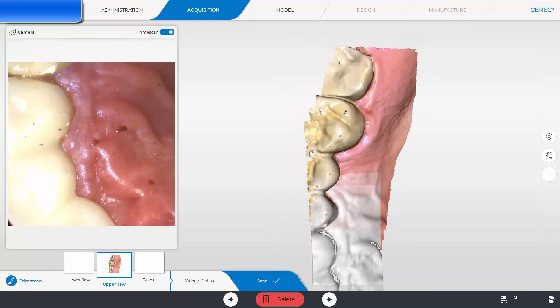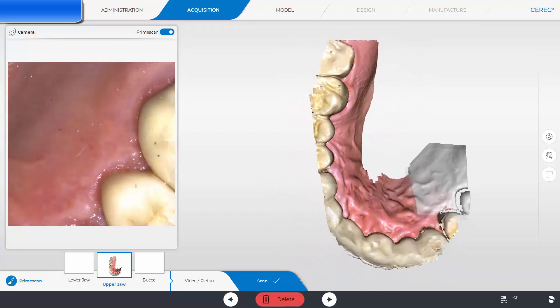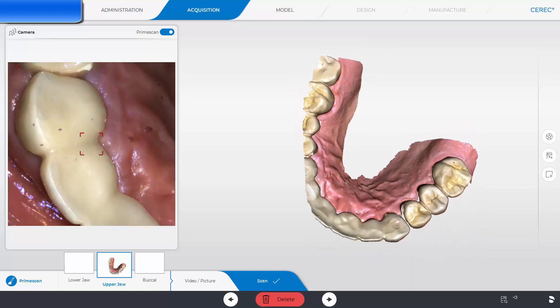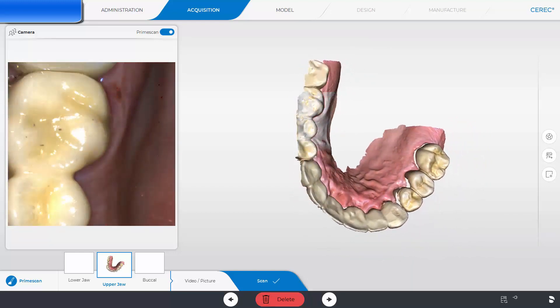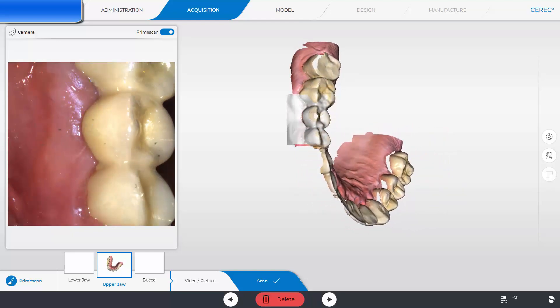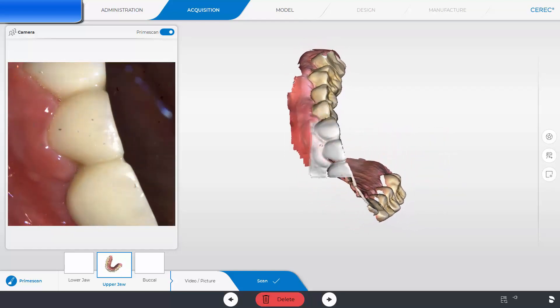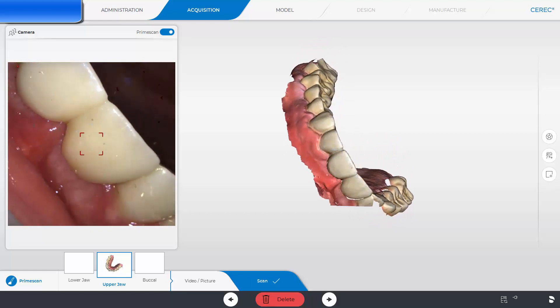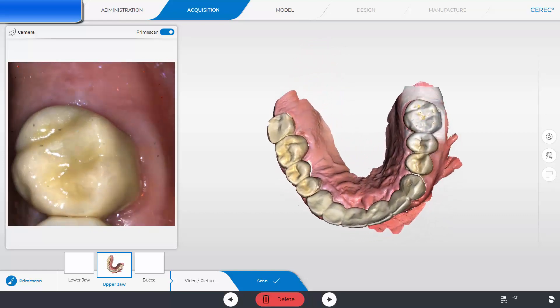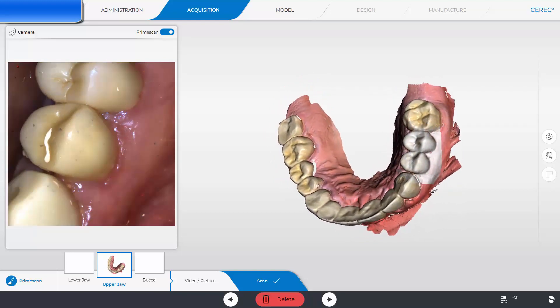This next full arch scan also roughly took 30 seconds but the situation is completely different. Not only is retraction difficult, but every tooth in this maxillary arch is restored with either lithium disilicate or zirconia restorations. As you can see, the PrimeScan can move through the arch and scan the restorations just the same as teeth — no additional strategies are needed to very accurately image them.